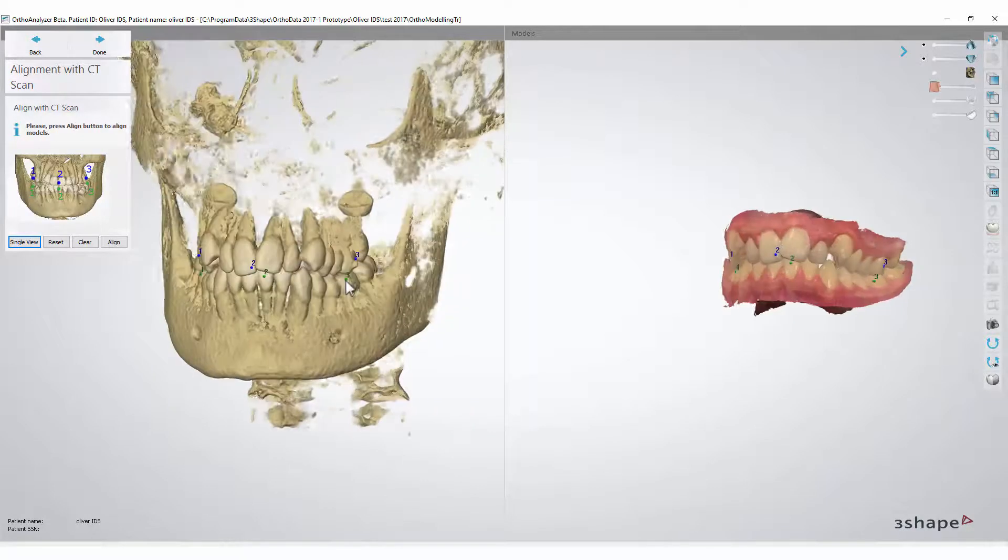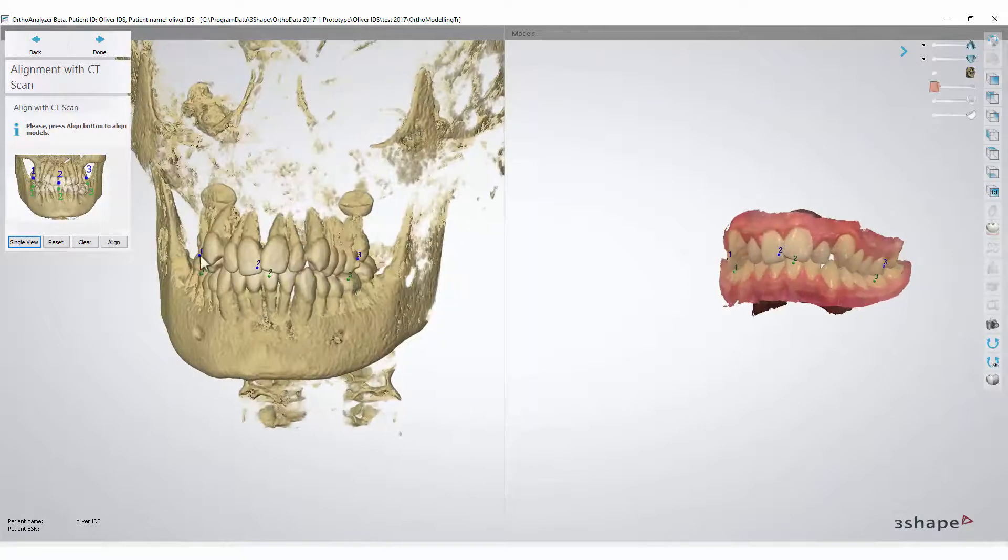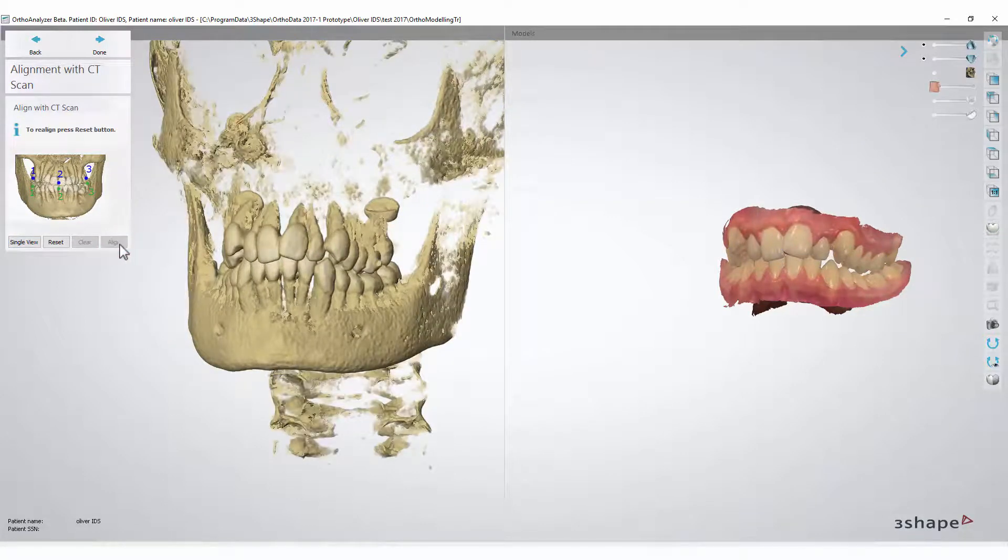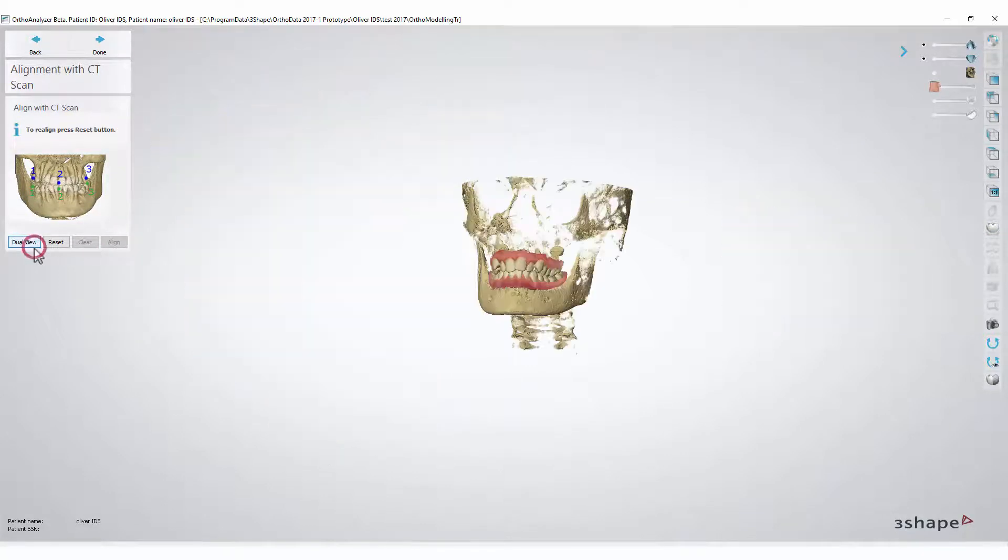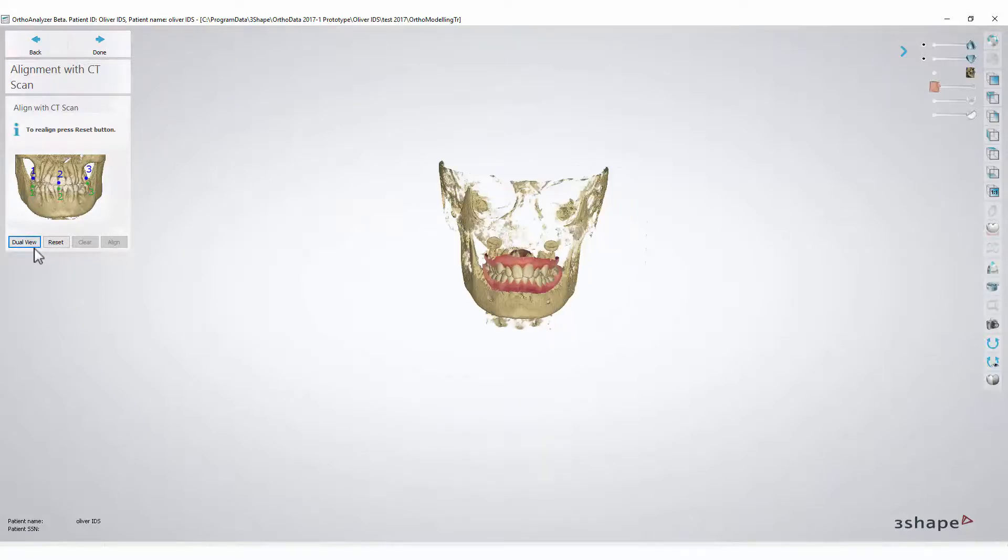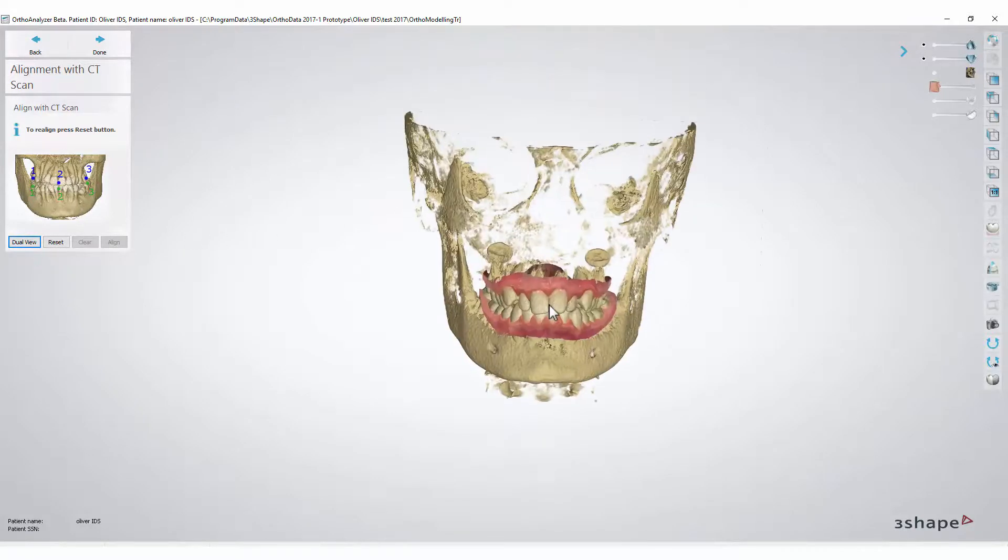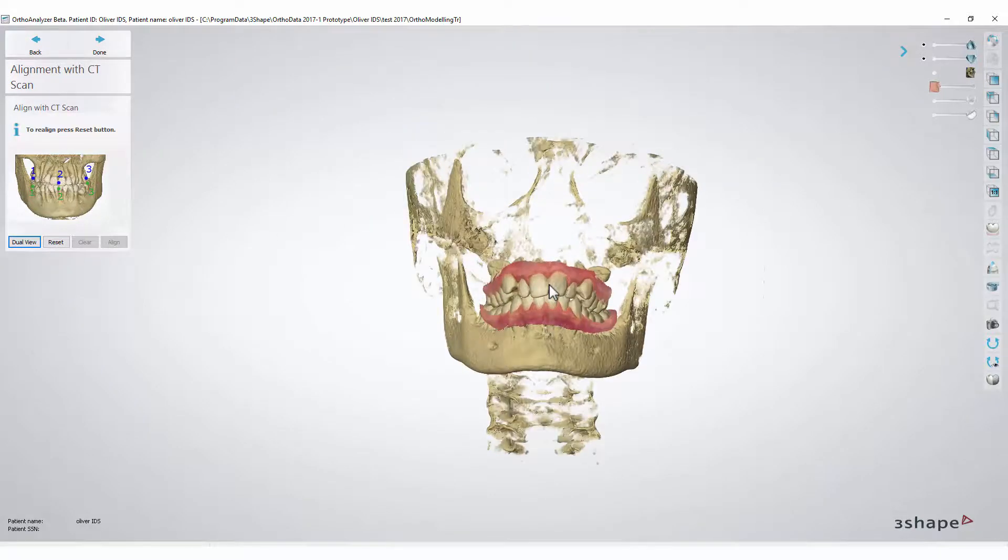Once you've set all the points, click Align. Then you can go back to a single view. As you can see, the model set has aligned with the DICOM scan.